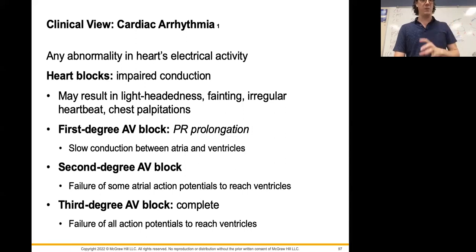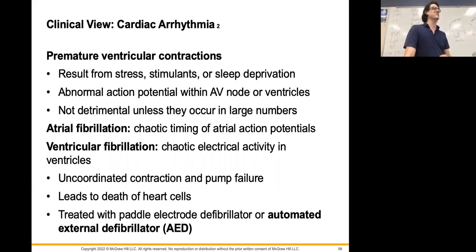And here, these are just some examples of what can cause this stuff. I'm not expecting y'all to be able to look at 10 different types of arrhythmias and identify them and tell me what's happening on them. I basically just want you to be able to tell me what is supposed to be happening in a P, what is supposed to be happening in a QRS, and what is supposed to be happening in a T, okay? Understand what a normal curve basically should look like, so that whenever y'all do take pathophysiology, you can understand what happens when you break some of these things, okay? I'm not necessarily worried about y'all understanding what VTach is, or atrial fibrillation or ventricular fibrillation, okay?